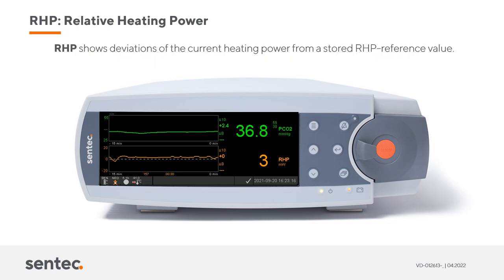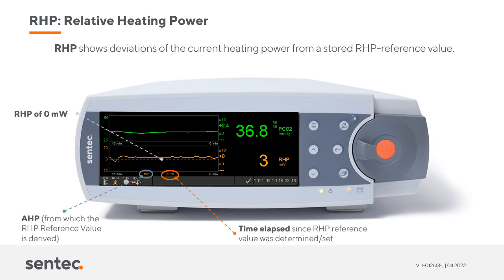Relative heating power, or RHP, is the deviation from the stored AHP value. After the CO2 stabilizes, the monitor sets a reference value of 0. Throughout the rest of the monitoring period, any changes in the power needed to maintain the sensor temperature will be shown as positive or negative changes in RHP. To put this into context, RHP has a relationship with the patient's perfusion. An increase in the patient's perfusion will result in a positive increase in RHP, while a decrease in perfusion will result in a negative decrease in RHP.